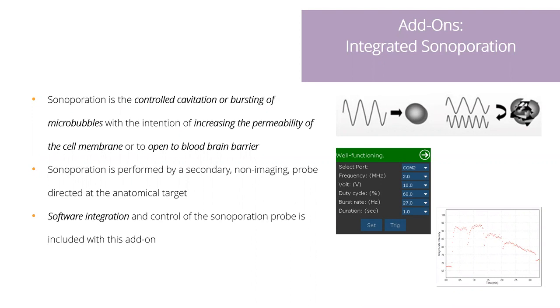However, sonoporation is actually the controlled cavitation of the bubbles, or bursting of the microbubbles. And this is done in a very controlled way with a specific amount of power. The goal here is to increase the permeability of the surrounding cell membrane or to open up the blood-brain barrier. So here we're not looking to image microvasculature, we're looking to open something up, the cell membrane again, or the blood-brain barrier.